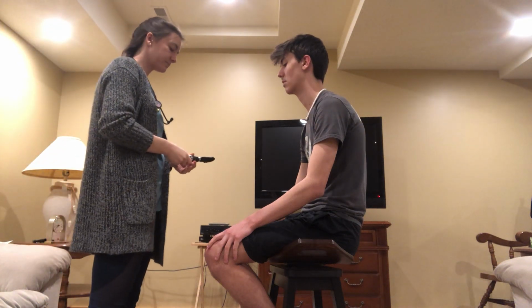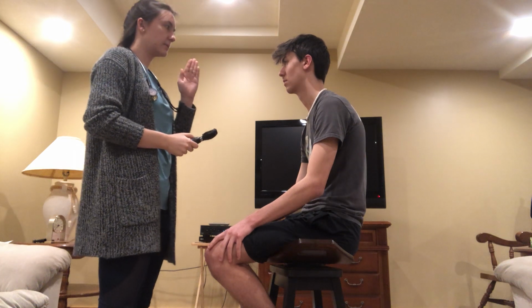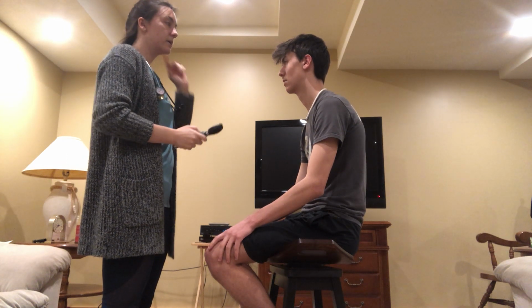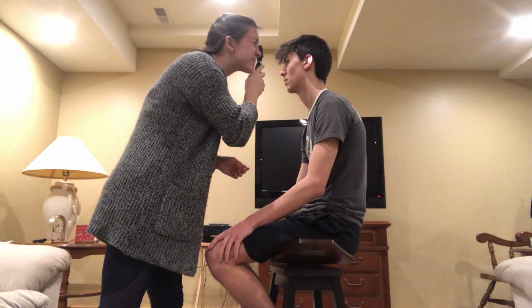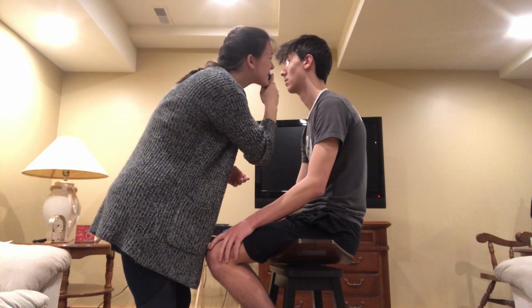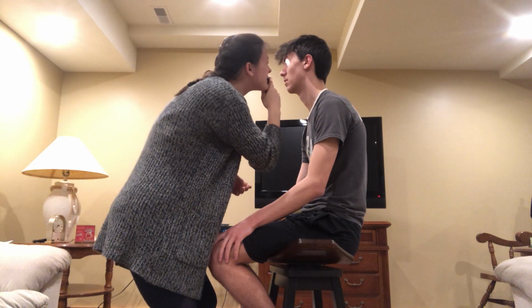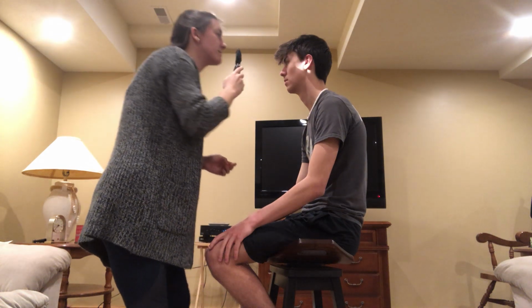Okay, and then I'm going to proceed with my fundoscopic exam. I'm going to position my patient using my left eye. I'm going to be looking at his left eye first. Go ahead and look at my ear as I do this, or at the wall if that's easier as well. I'm going to look for the red reflex. I'm going to look for the optic disc, and then I'm going to have my patient look into the light in an effort to visualize the macula.